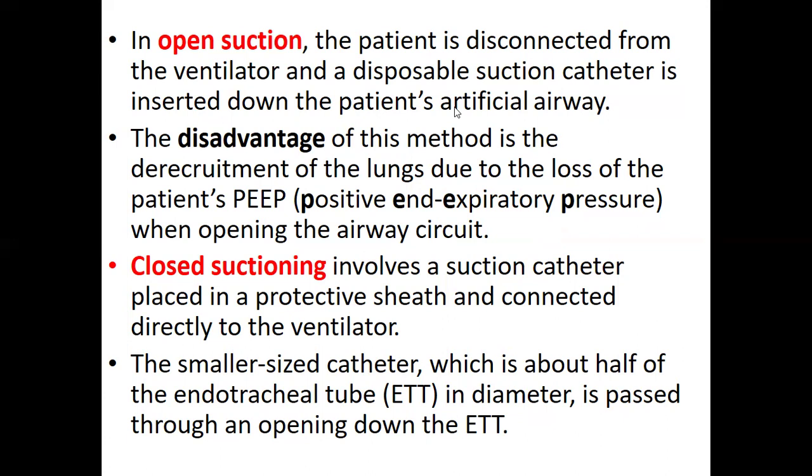In open suctioning, the patient is disconnected from the ventilator, and the disposable suction catheter is inserted down the patient's artificial airway.